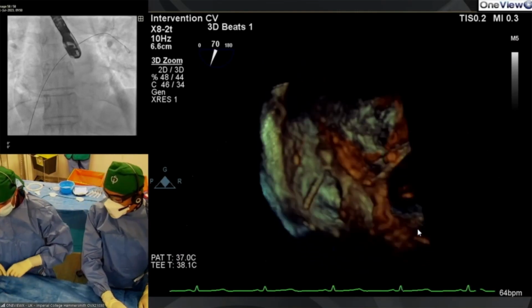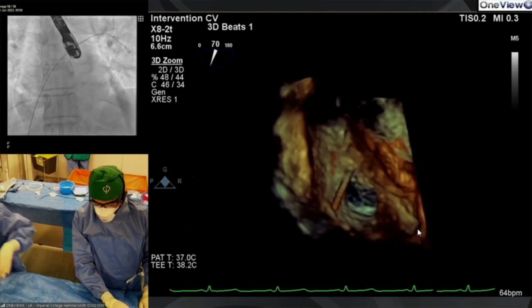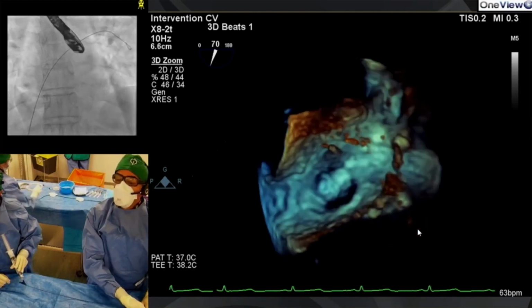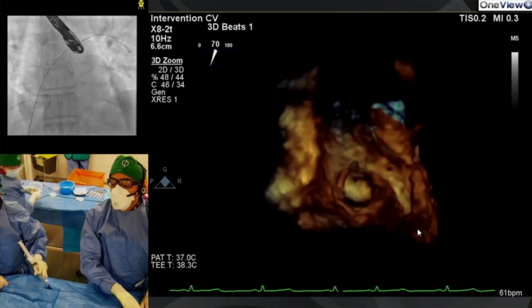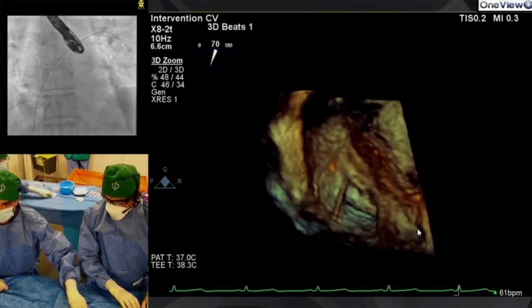Okay. Would you be worried about the prominent tissue on the right side? Well, you've got to get a seal on one side or the other. So, I mean, basically, PFO devices come in 3 sizes, right? There's a big one, a small one, and a medium one, and you're going to use the medium one. So I wouldn't be fiddling about or the big one. Why didn't you use the stiff wire there, Neil?